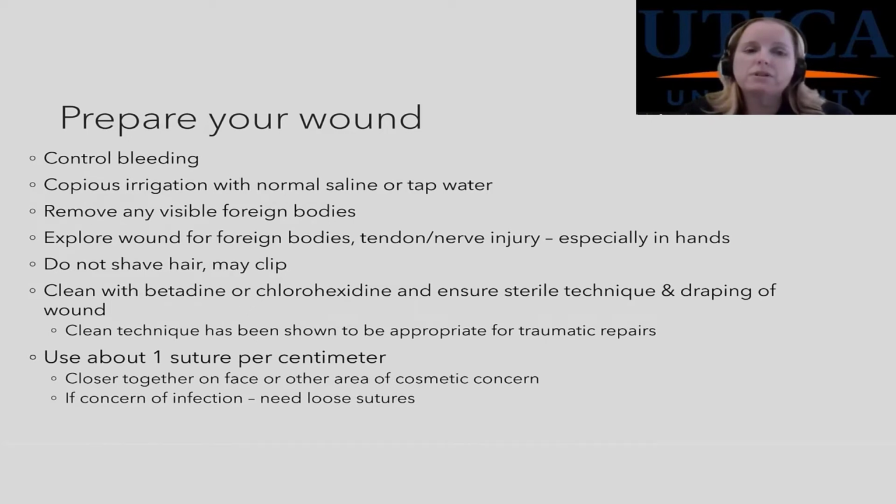If there is a concern for infection, then you have to make your sutures a little bit looser. You don't want it to be super tight. Also, it's going to be super hard for you to get the sutures out when they're ready to come out if you make them incredibly tight, or if you clip them very, very small. It makes them super difficult to get out. But you also don't want to make them incredibly loose either. So you need to find that good medium.